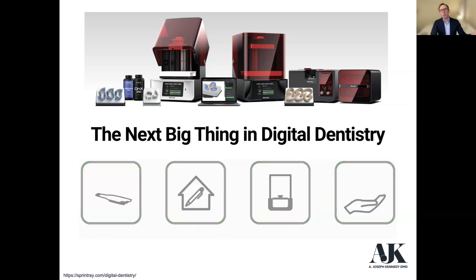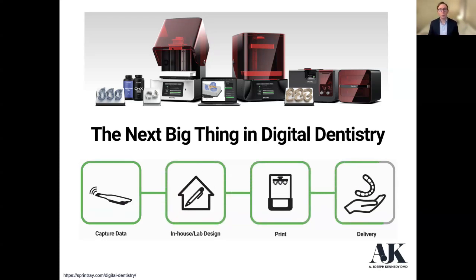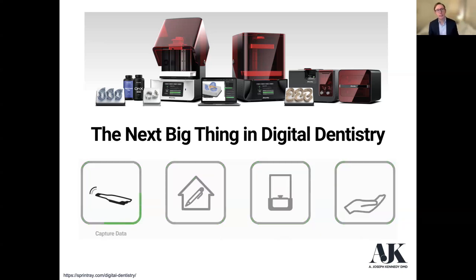So what do we do? We capture data. I liken it back to that iPhone where we have this device, and what can we do with it? Well, we've got that digital scanner. What can we do with it? We can send it to a milling unit and do subtractive manufacturing. We could send it to a 3D printer and do additive manufacturing. Each has their pros and cons.